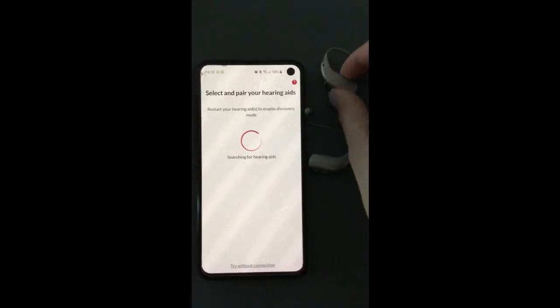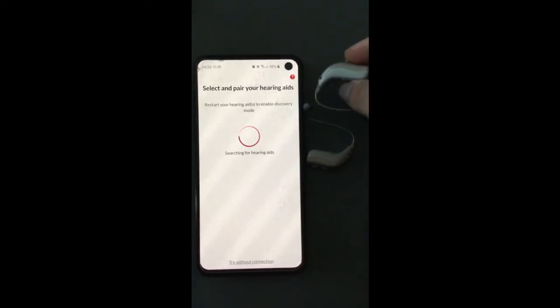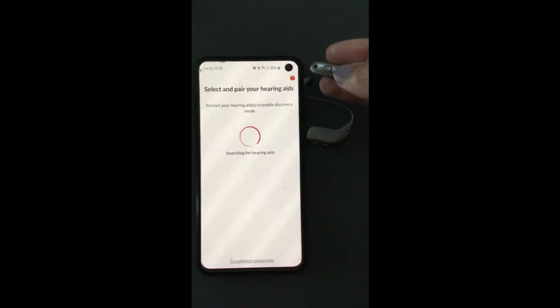To find your hearing aids: if you've got a battery-operated hearing aid, you need to turn it off by opening the battery door, and turn it on by closing the battery door.